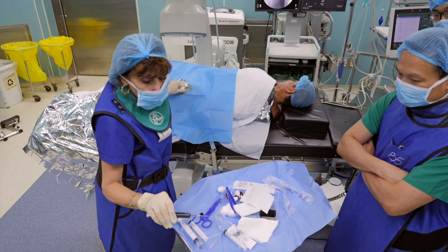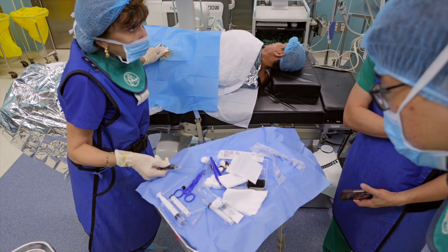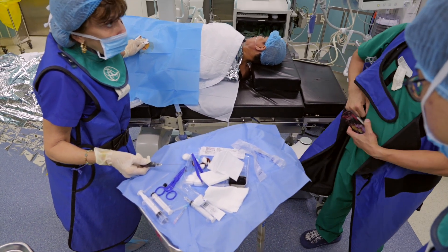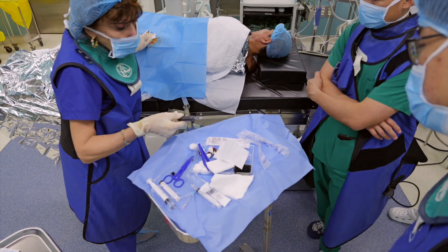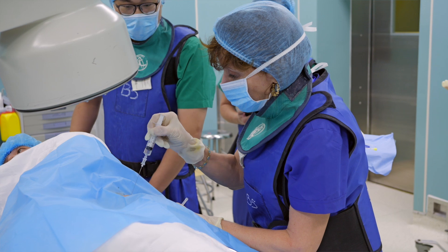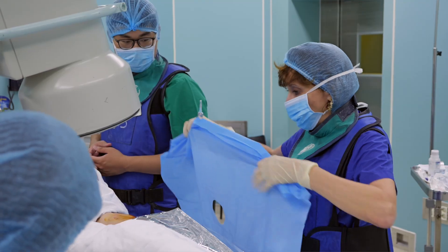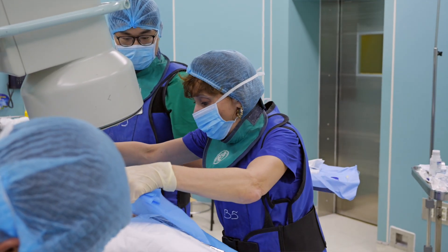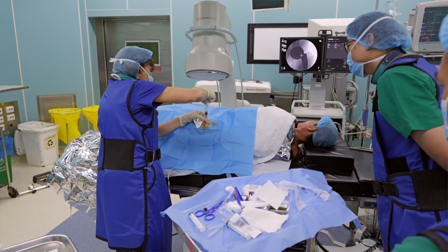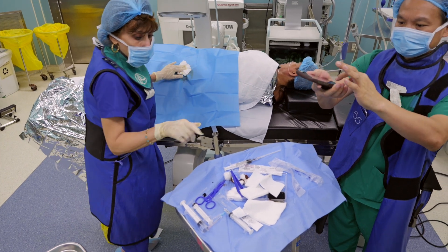That is what happens when you have an implant where metal is rubbing against plastic, and that's going to produce metal debris. Today I taught them how to do the procedure in a way that is quite fast, does not require anesthetic for the patient, and avoids the potential complications of vessel or nerve damage. It's a very simple way to do a hip aspiration.